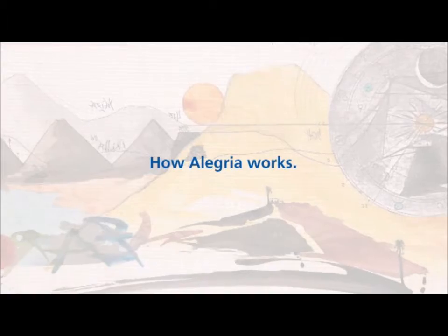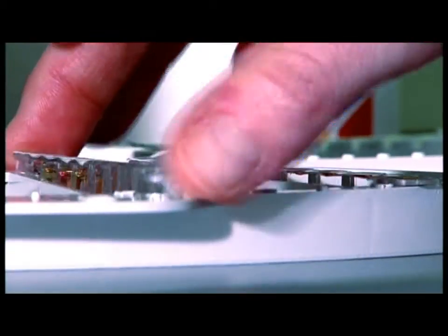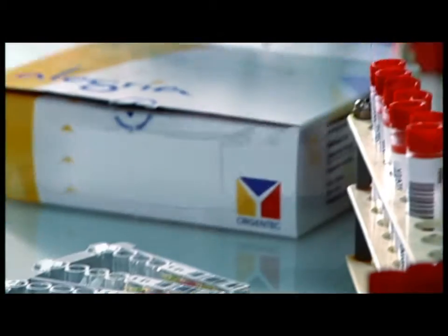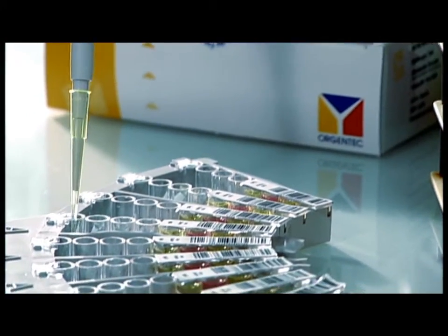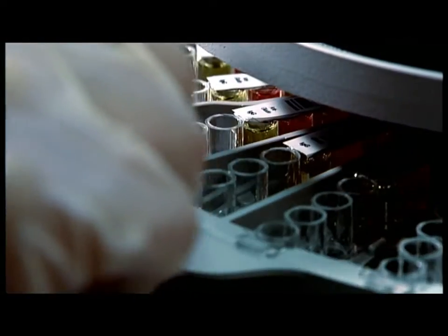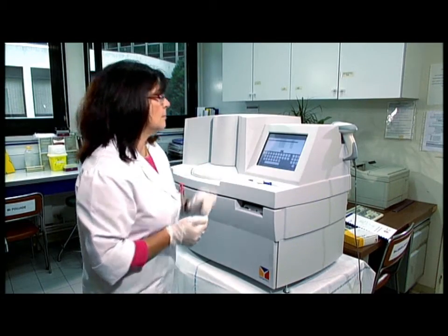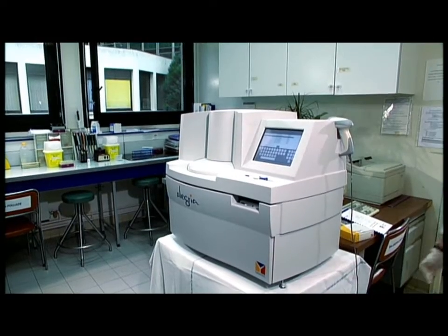As for the way Allegria works, you simply select a specific test strip, allocate it to a specific patient using a barcode, pipette the corresponding patient sample into the strip, and insert the strip into the Allegria system. That's all there is to the preparation process. Allegria takes care of the rest of the work from here.